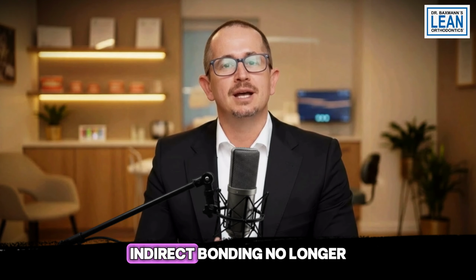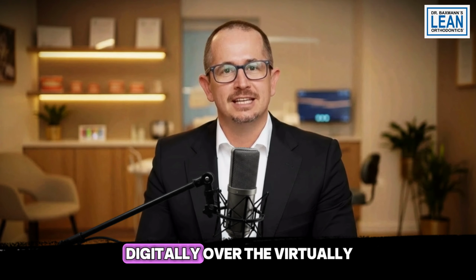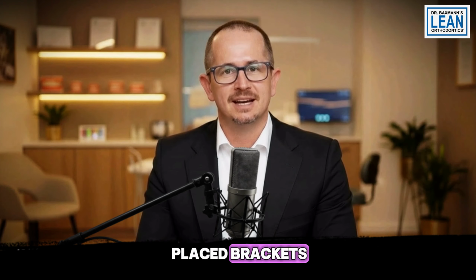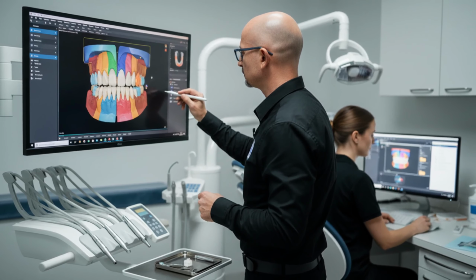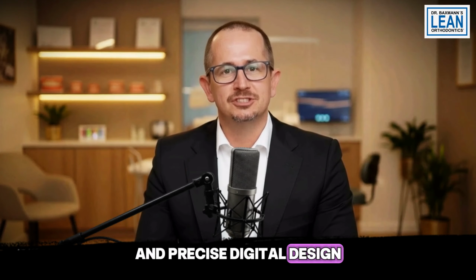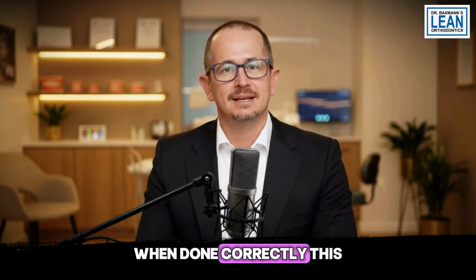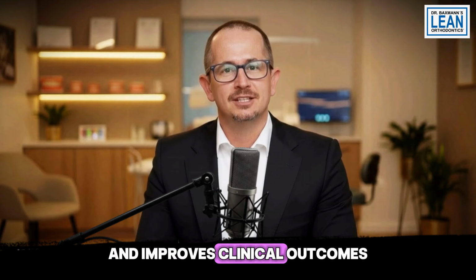Today, indirect bonding no longer requires printing physical setup models and thermoforming trays manually. Transfer trays can be designed digitally over the virtually placed brackets and printed directly. Fit, stability, and bracket positioning depend entirely on scan quality and precise digital design. When done correctly, this workflow significantly reduces chair time and improves clinical outcomes.